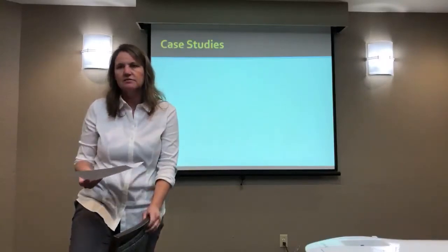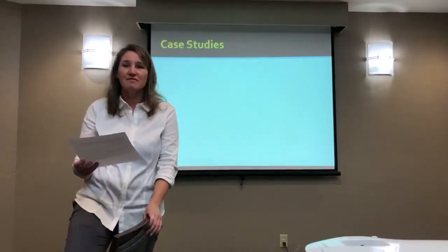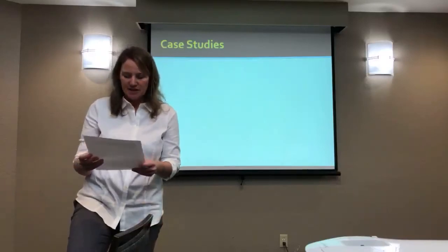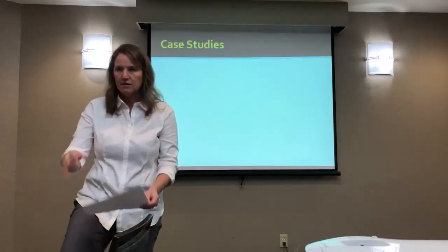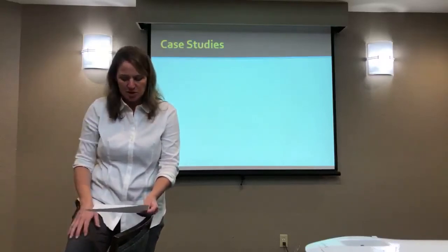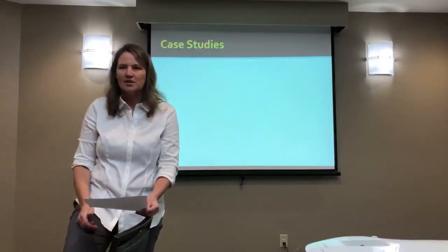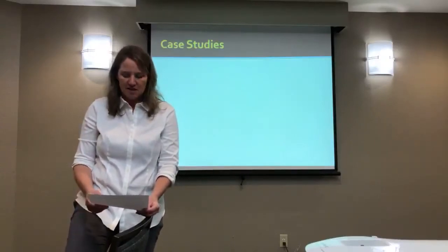And your technique. How would you position the person? I would just say a position of comfort. A position of comfort that exposes the ligament. A little flexed over a bolster, just a comfortable, slightly flexed position, makes sense to me. Certainly not a position of stretch or anything like that.